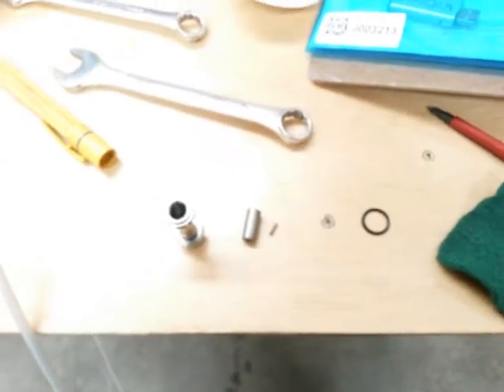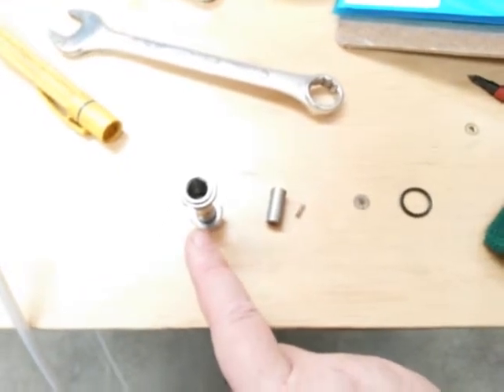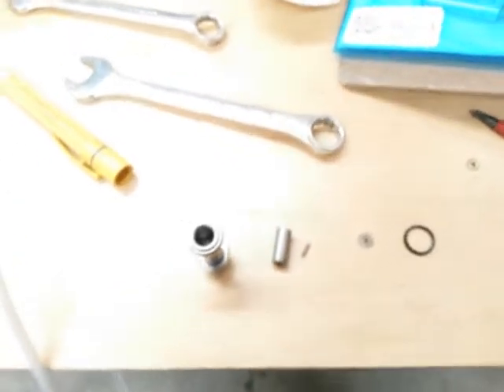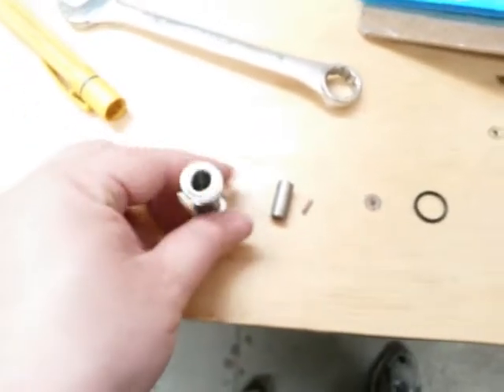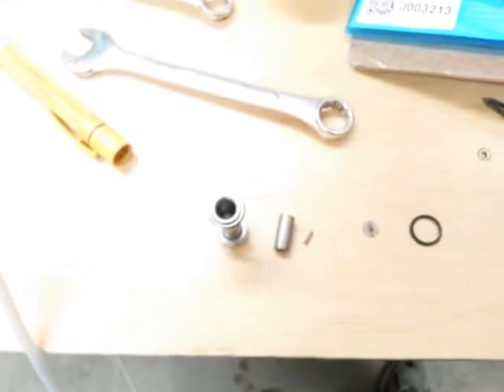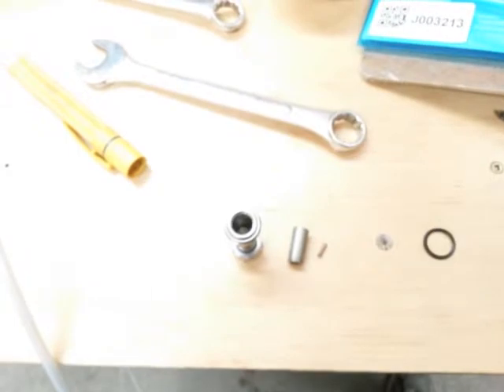You'll see the parts: the stem, the poppet, the spring, the little copper washer, and the O-ring. It's important to make sure you only have one copper disc in there — sometimes if you don't blow the original one out when you repair it, you end up with two. We've now cleaned out the inside with a bit of Scotch-Brite, given it a blow out with compressed air, and we're ready to reassemble the solenoid valve.